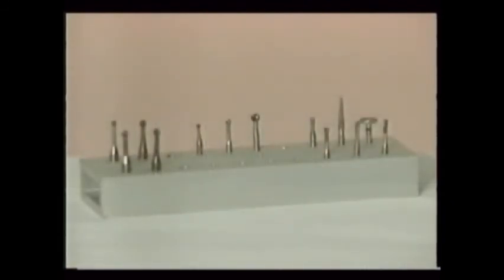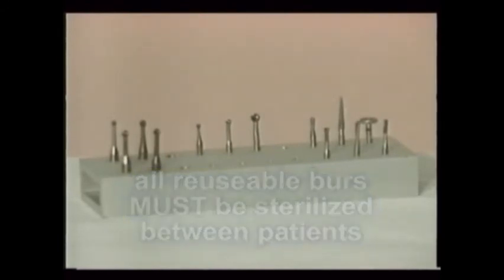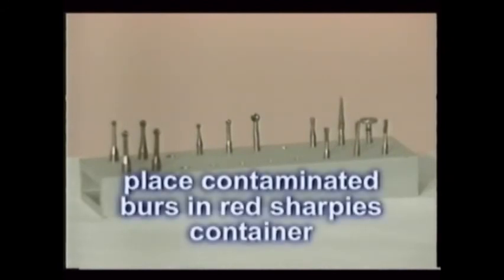The burr block holds the various burrs. It's often also their container used during sterilization. All reusable burrs, usually diamonds and finishing burrs, must be sterilized between patients. One-use disposable burrs are preferred and should be used when possible. Be sure to discard them in a red sharps container after use.